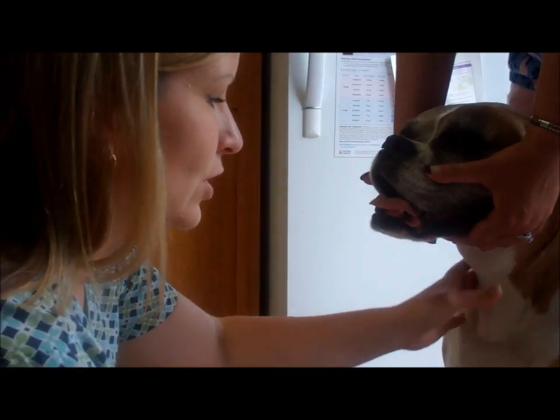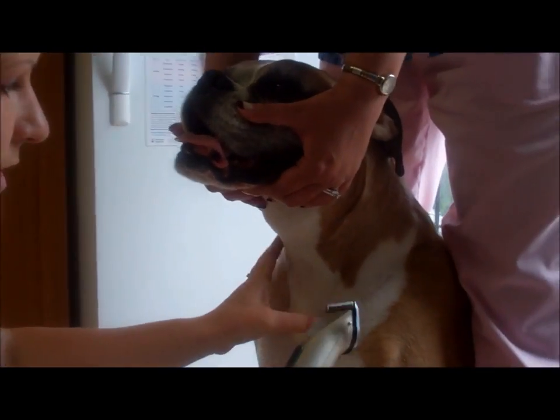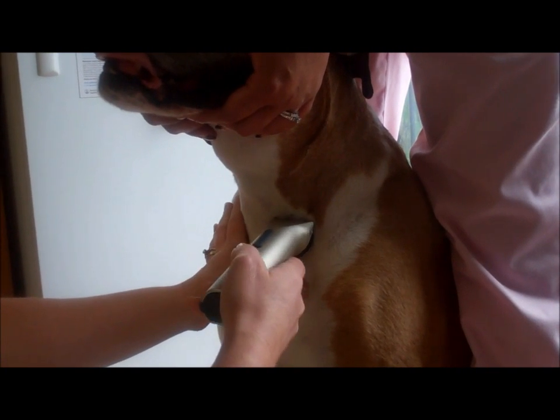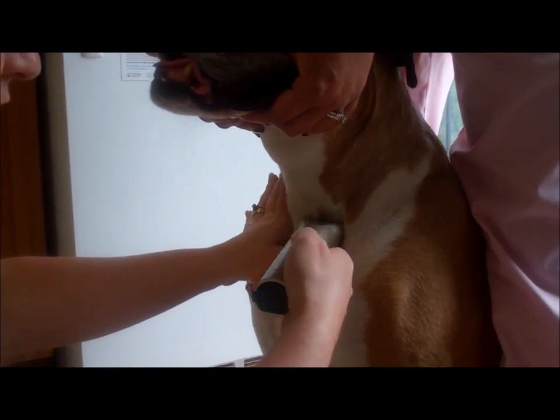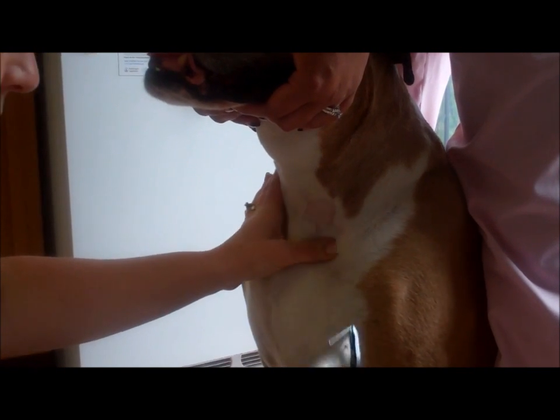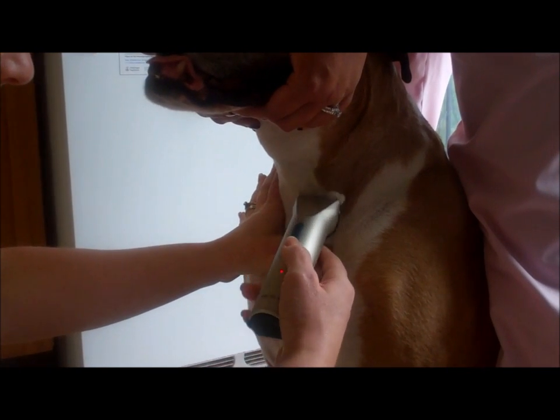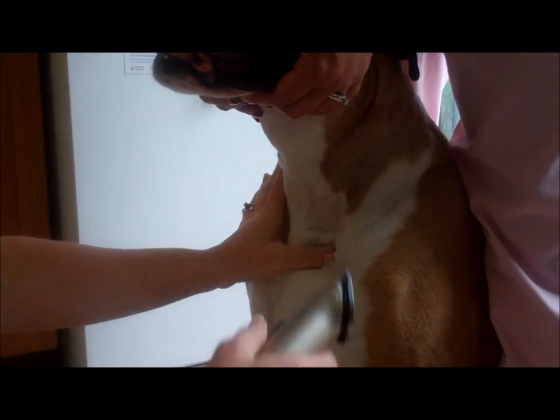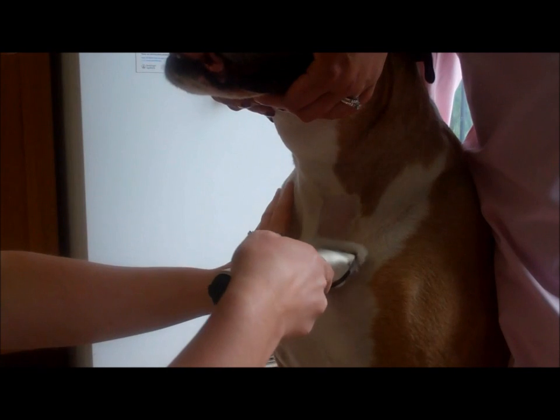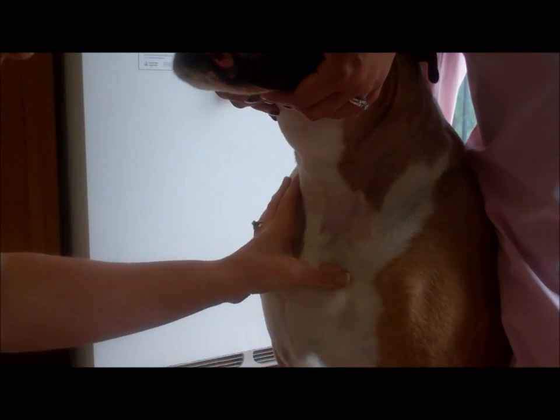Until you're good at the technique, you should be shaving that area to give yourself just a small window. Once you're proficient and have become very good at the skill, you should not have to shave in order to see the vein. But for the sake of this video, we're going to shave so that it makes the jugular vein visible.